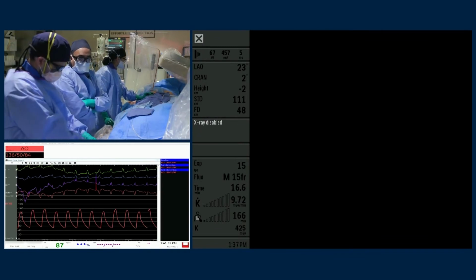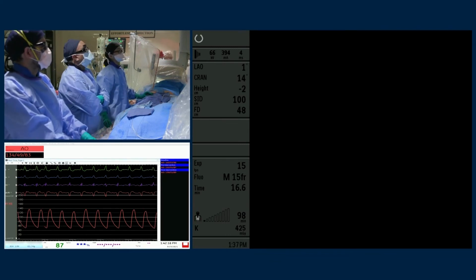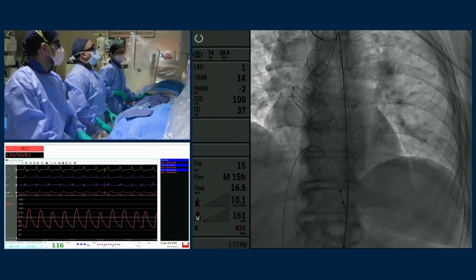So in a second, I think we'll show you an aortogram too. We'll do a final aortogram, and in this case, we really wanted to show the advantages of commissural alignment and how, even though we have a tall valve, it doesn't impact in a big way coronary access, particularly if you optimize commissural alignment. So we'll give you an aortogram now to really have a sense of what the result looks like as well.